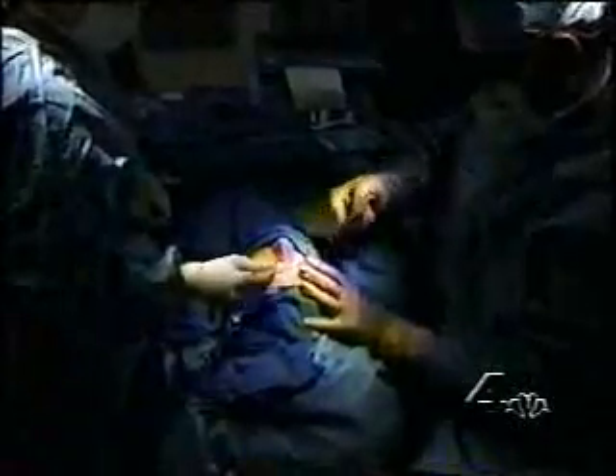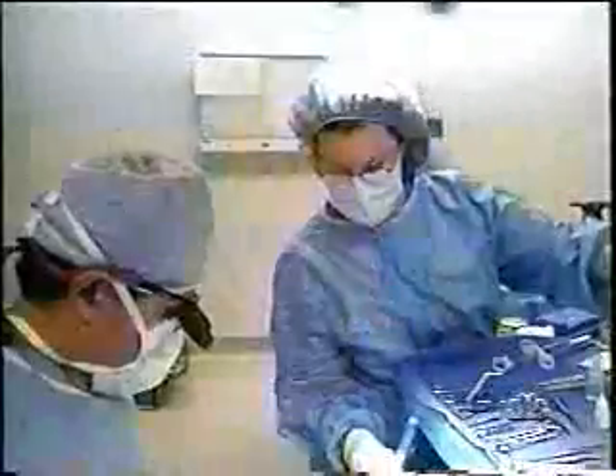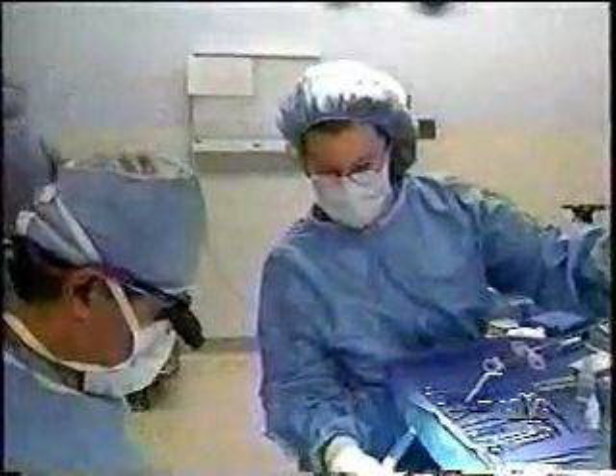Dr. Asadi says that stitches do yield excellent results in the eyelids, but that patients can sometimes feel them, or they have to be taken out. Plus, stitches can cause whiteheads to form in the skin. So Dermabond is ideal here.